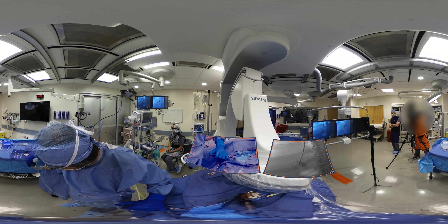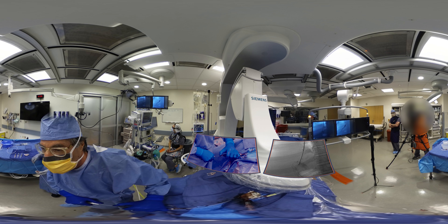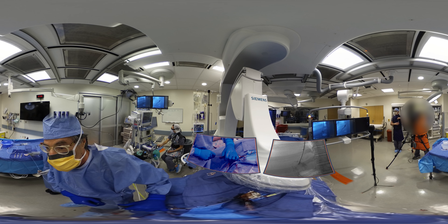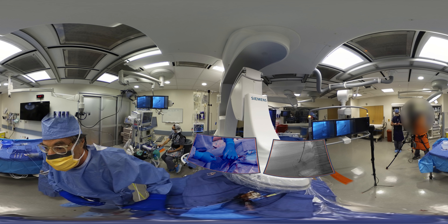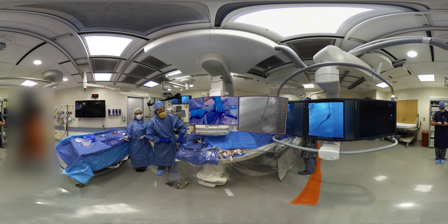Take that torque device. The lights are up a little bit brighter in the room than I usually would have so that you can also see on camera. Now I'm just gently manipulating the wire, and what I'm feeling is that I'm really just in parenchyma. We don't really want to carve around with this wire because we can easily create a parenchymal defect and a pseudoaneurysm, especially in a less cirrhotic liver, even though this is pretty fibrotic. So that's not leading anywhere.